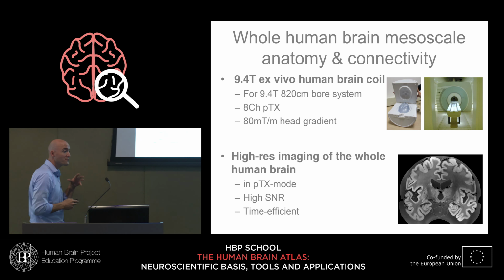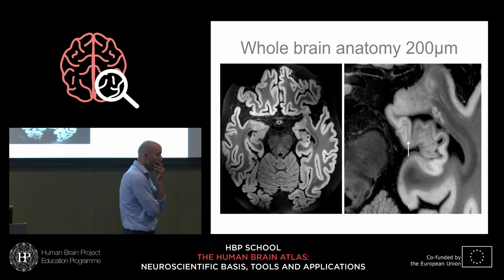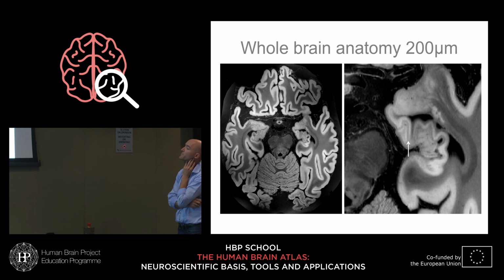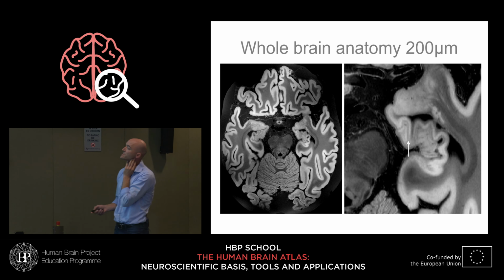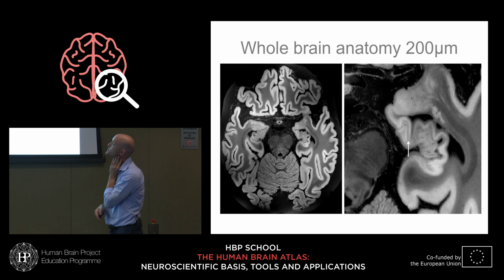But all right, we've taken care of all of that. And so the first image that we did about 2 years ago, which Rainer also showed you, was to go down to 200 micron. This is an entire human ex vivo brain. Here you see posterior, anterior. You see that it's about at the level of the superior cerebellum, and you see the hippocampus over there.